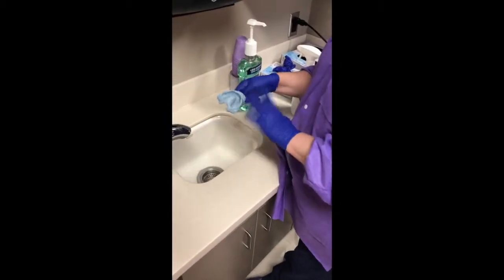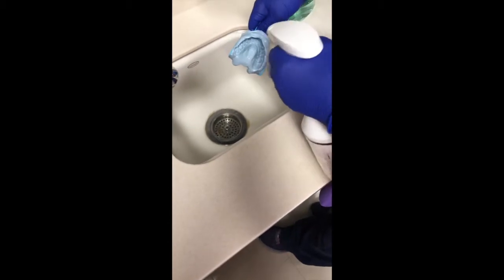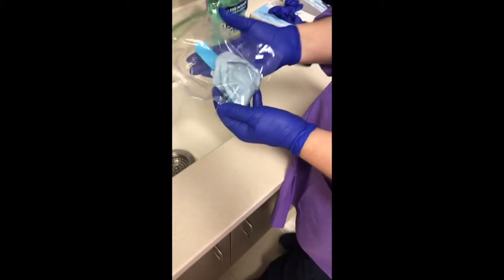Okay, so at the conclusion of taking your impression, you're satisfied with how it turns out. You're just going to rinse it under running water, kind of shake it out a little bit. We spray it with a bleach water mixture and shake it off a little bit, and it'll go in a Ziploc bag until we can get to the lab to pour up the impression.